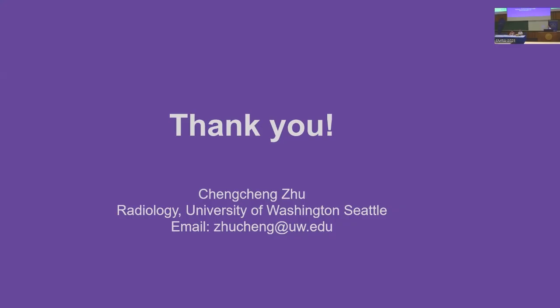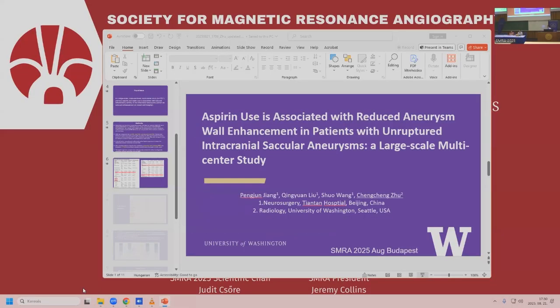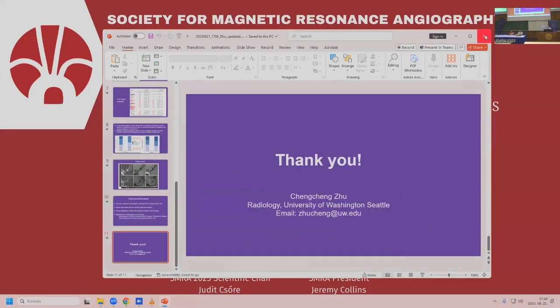Okay, thank you. And I wonder, because you use black blood images, so did that work well, or do you sometimes suffer from poor blood suppression so that it's difficult to quantify the enhancement, or is that valid?